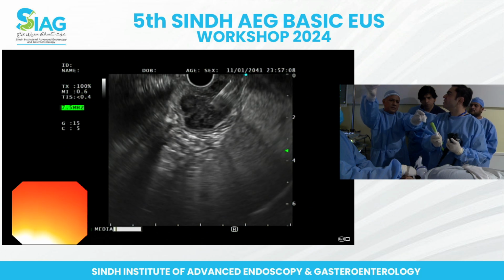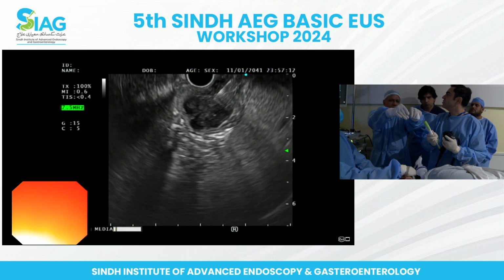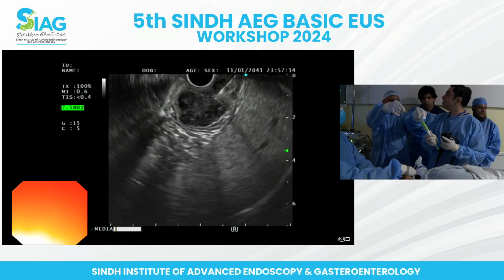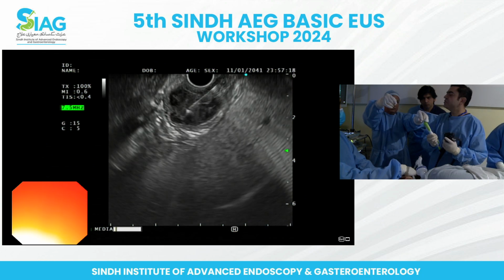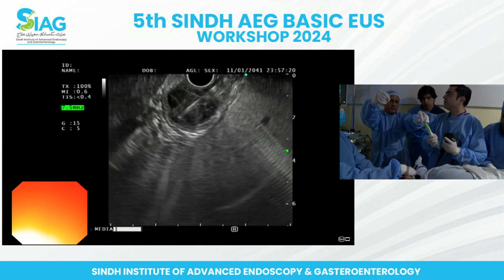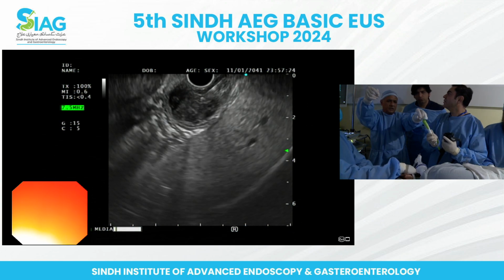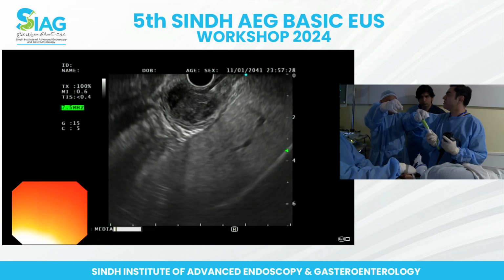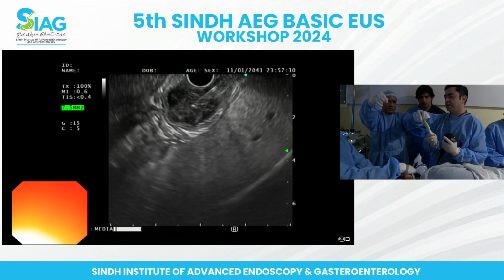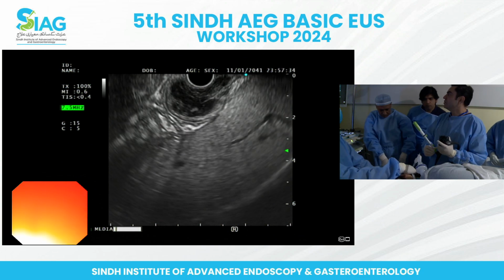So we'll just try to see if we can fan it a bit. Yeah, excellent. So we'll try to get the sample without the first, and then we'll see. Yeah. Okay. Yeah, excellent. That's fine. That's fine. I think we got it. Yeah, you can pull it out.